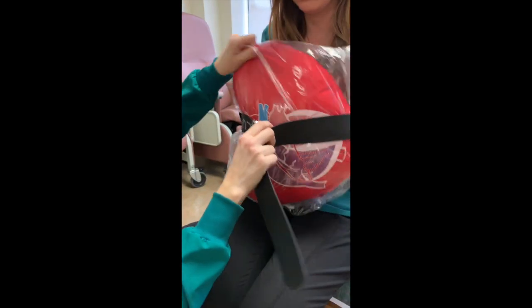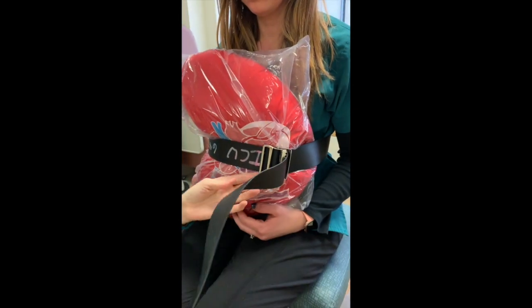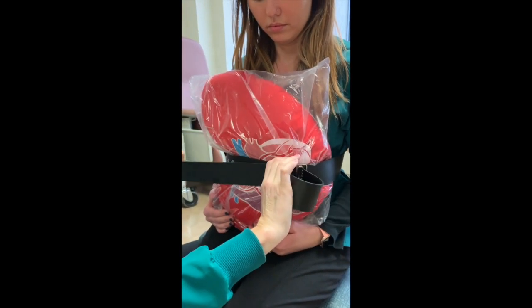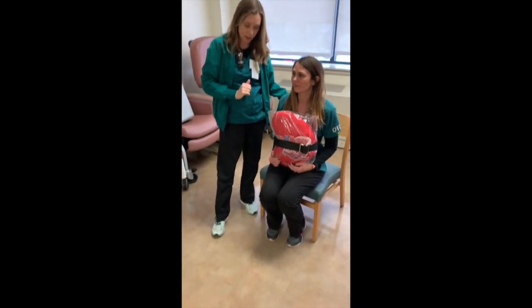So again, through the teeth, cinch it down. This just kind of protects their incision a little bit. It also makes it so the chest tubes don't wiggle around as much, making it a little more comfortable for your patient to walk. So then it would be the same thing from there if you're walking them.